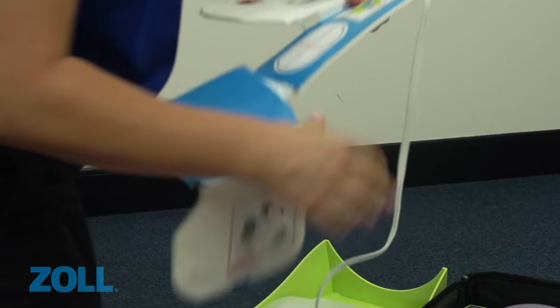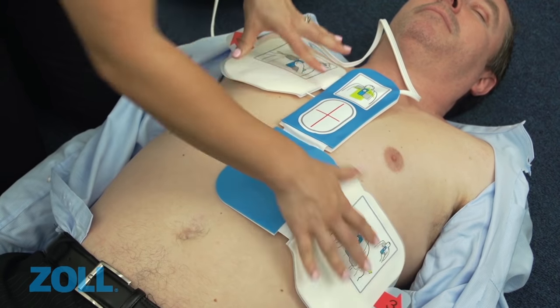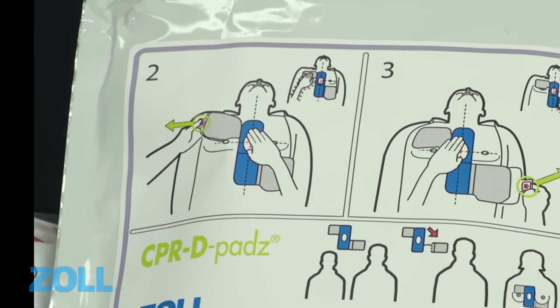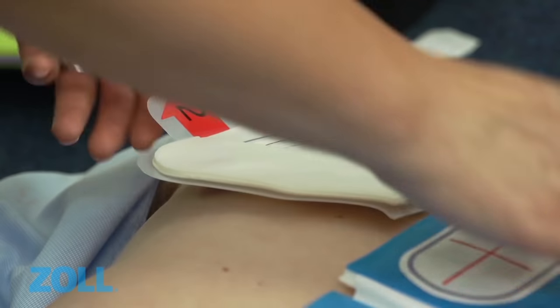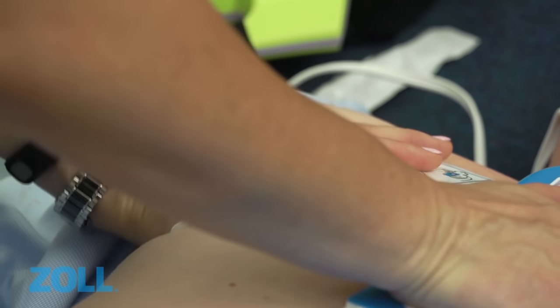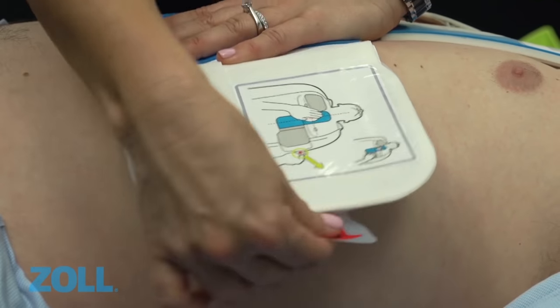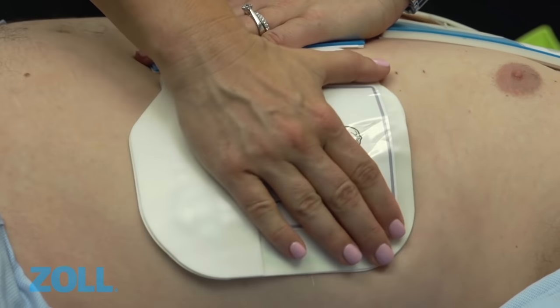Using the sensor's crosshairs to guide you, align the CPR landmark between the victim's nipples and the middle of their breastbone. Press the CPR landmark with your right hand and pull the number 2 tab to peel the protective backing from the electrode. Press the electrode from the center out to make sure it adheres properly to the victim's skin. Repeat the action on the lower pad marked with the number 3 tab.